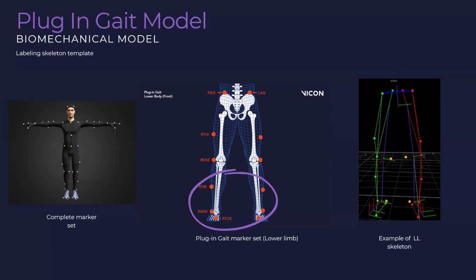It indicates where the body is in regard to the foot position, I would say. For example, if you're starting the stance phase, which is basically when you start putting your foot on the ground, your body is a little bit backward, and then you're moving forward, and that is going to be reflected in the COP trajectory. So what is COP, just to be clear? Center of pressure. Basically it projects the center of mass onto the area.